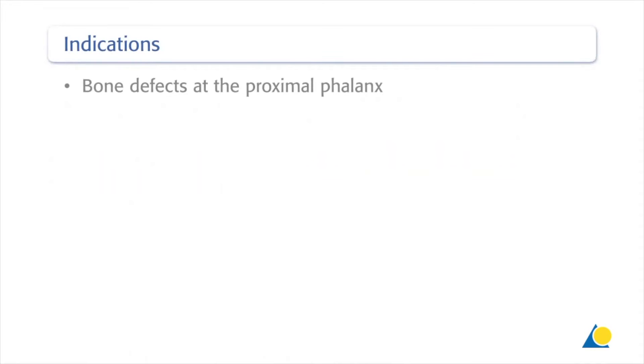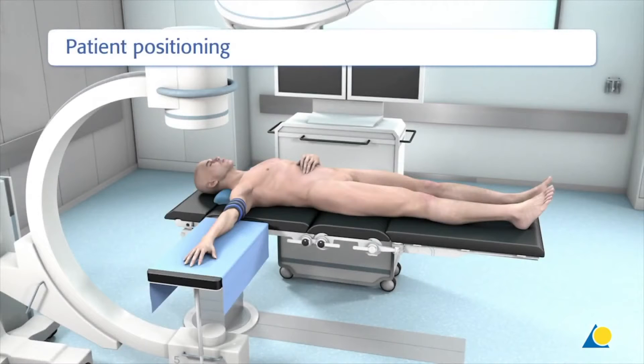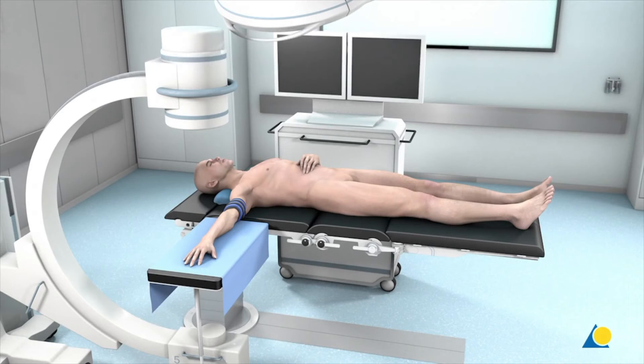This approach is indicated for bone defects at the proximal phalanx. The patient is positioned supine on the operating table with the arm placed on an arm table at the level of the shoulder joint. The use of a tourniquet is strongly recommended. A fluoroscope is positioned opposite the surgeon to allow intraoperative radiological examination.